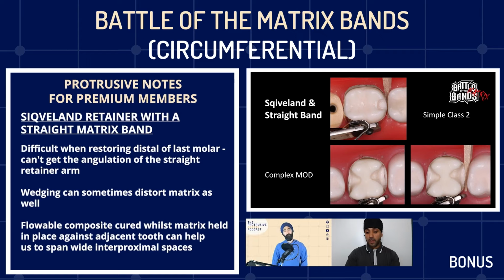Yeah, typically, I'll be revealing later why I don't need to do that too often. But in the most extreme of cases, it's still a requirement. When I've got something supremely subgingival, you can imagine the distance from the base of that cavity to the next tooth can be really exaggerated. That's when that technique is really quite helpful.